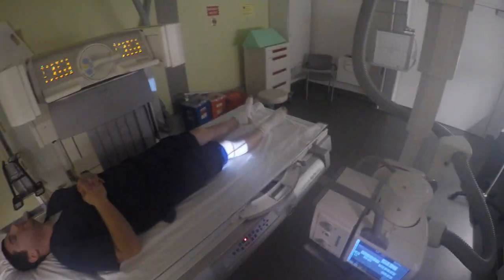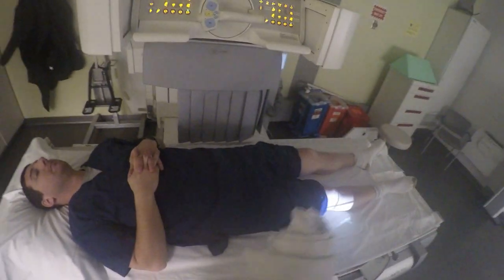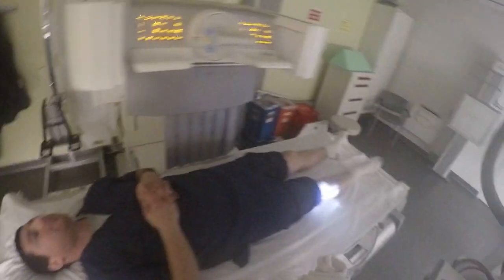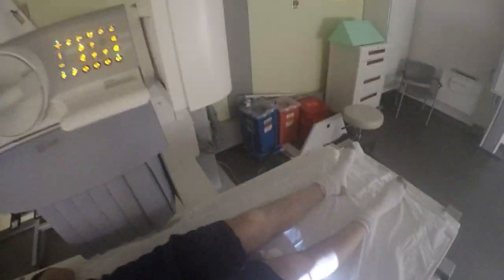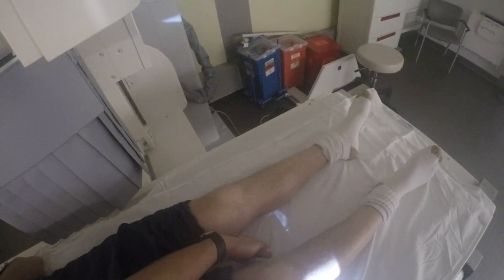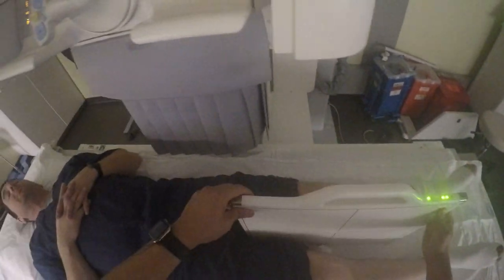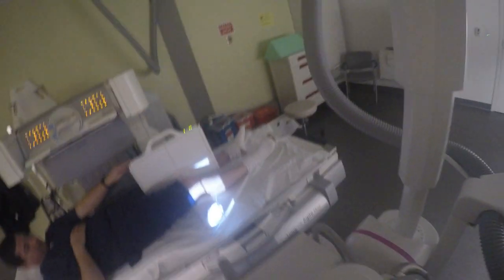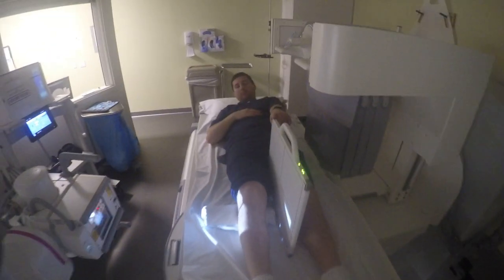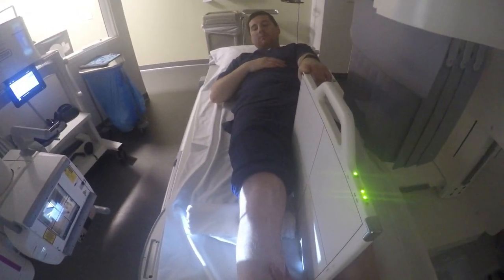I'm going to put this cushion under your knee here to prop it up. Are you going to hold this board for me? Bring it up to where it's not too uncomfortable. Is that okay? Yes, alright, thank you. I'm going to bring your leg inward here a little bit more.